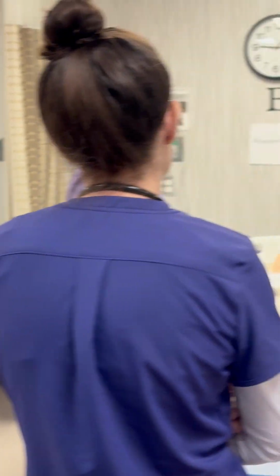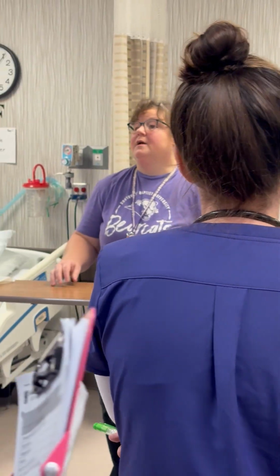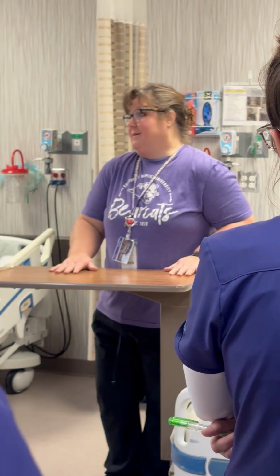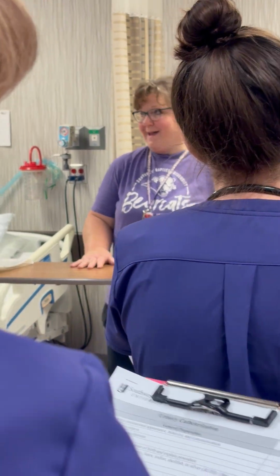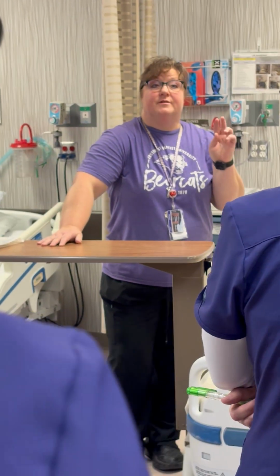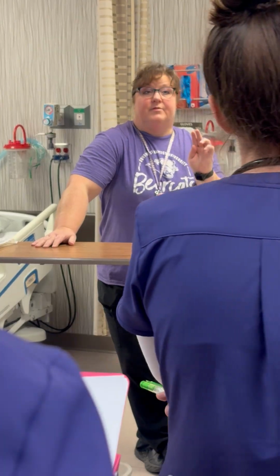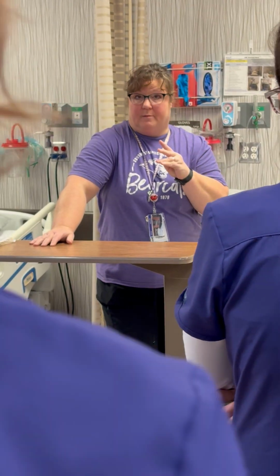If you get into the room and you start your procedure and you have the wrong catheter, you don't pass that check off, okay? There's 4 different types. So there's a male in and out, there's a male indwelling, and a male intermittent. There's a female indwelling and a female intermittent, okay?